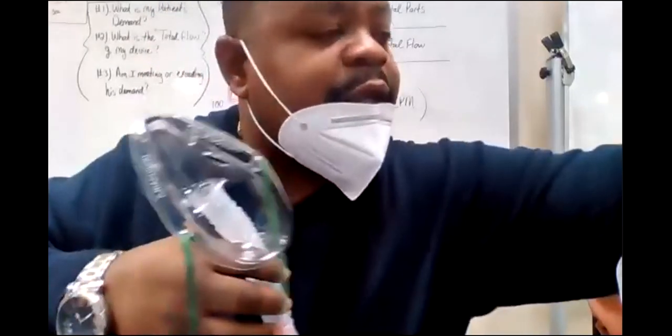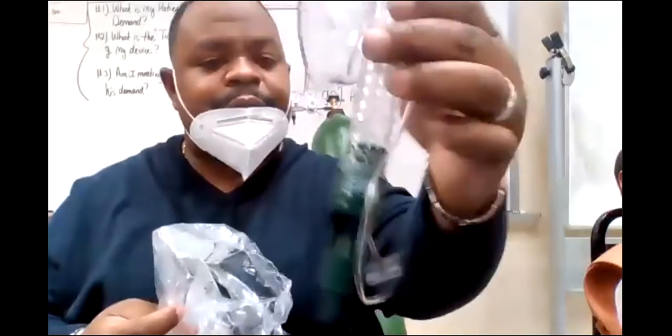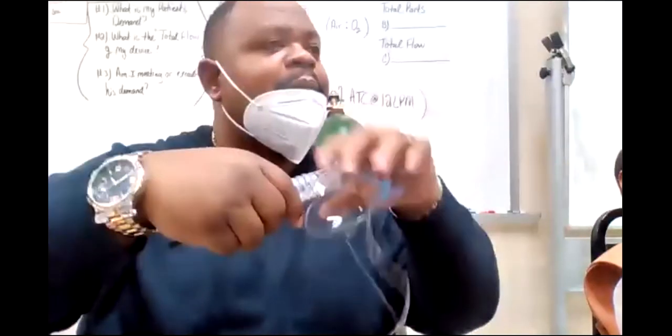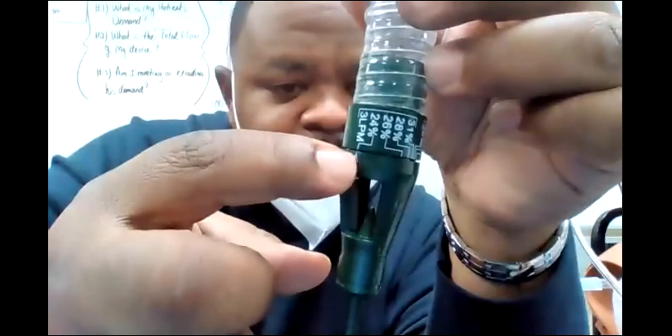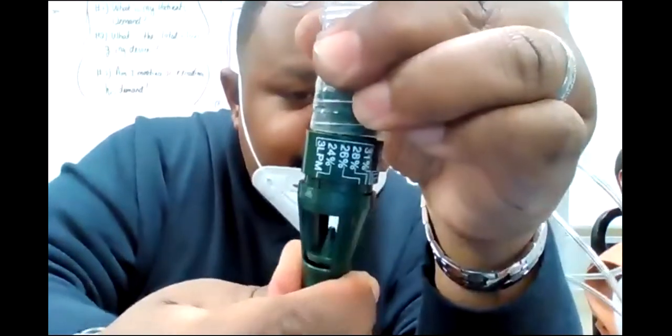This right here is the same thing I just used, but already put together. See? They already put it together. Somebody making money. Look at this one. It already has the FiO2s and the liters per minute. And look, all I do is just pull it down and turn it, okay?